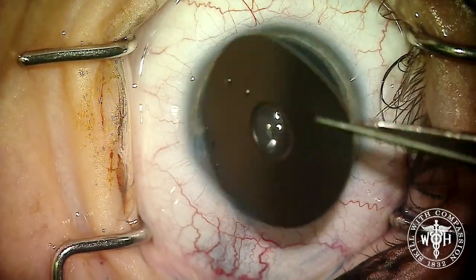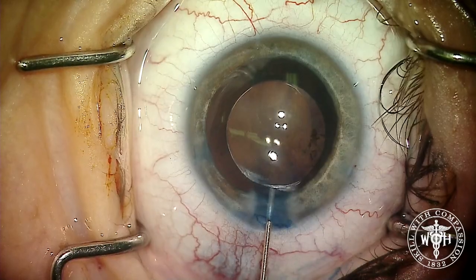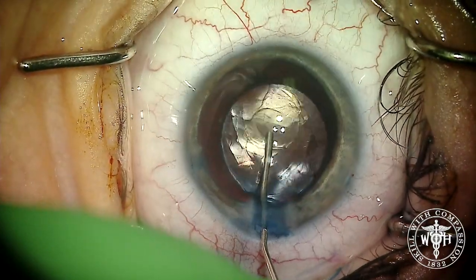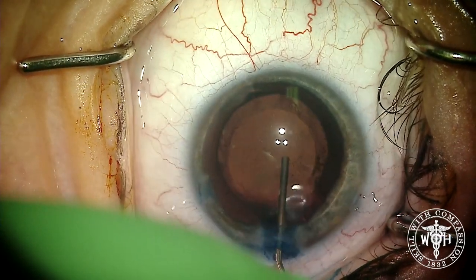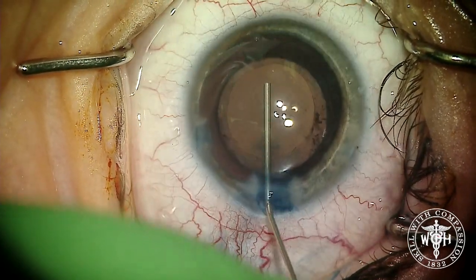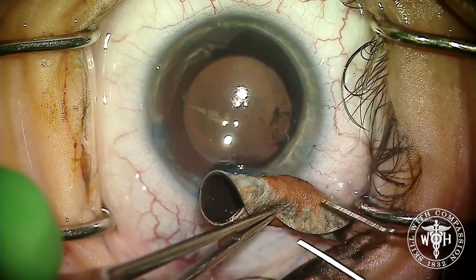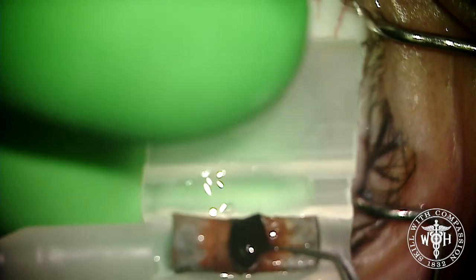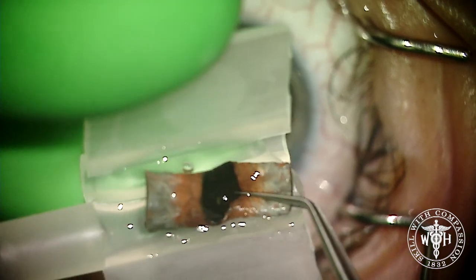This is the HumanOptics artificial iris — it has a black background made of silicone, and the anterior surface is custom matched to the color of the unaffected iris in the patient's other eye. We deepen the anterior chamber, push the IOL to the back of the capsular bag, and roll this synthetic iris in a taco fold — a third, a third, and a third fold.